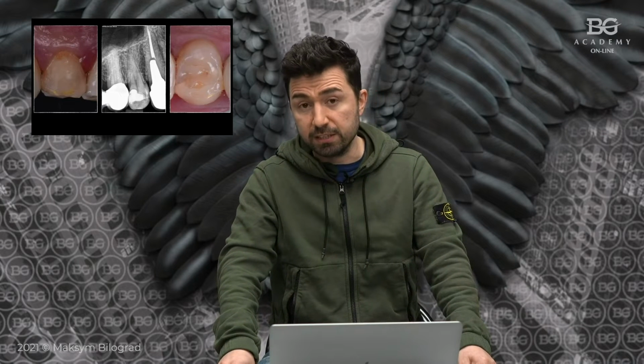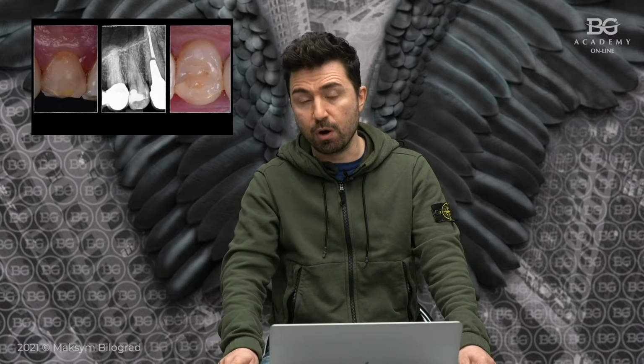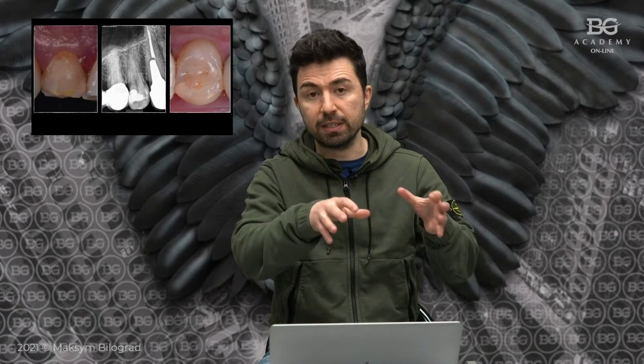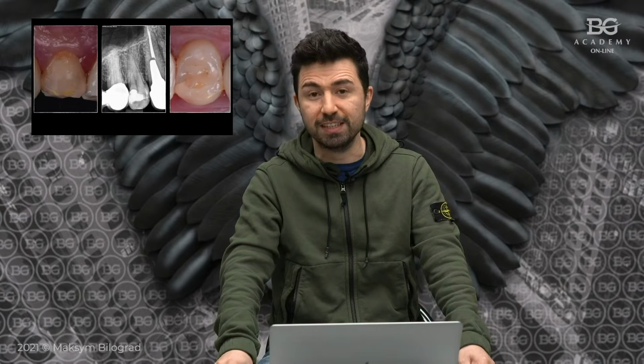Restorative-driven endodontics. Very interesting case where you will be able to see step-by-step approach from restorative planning to endodontic treatment and final preparations for indirect restorations. Let's go.